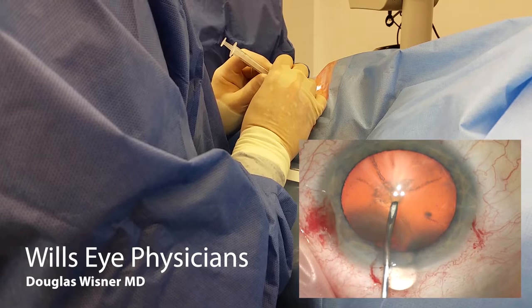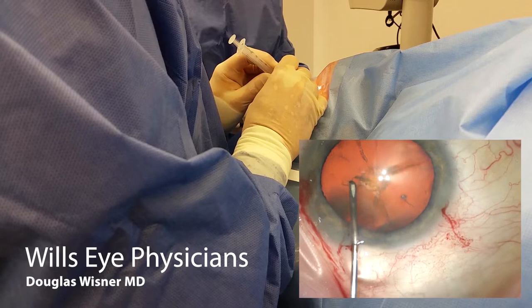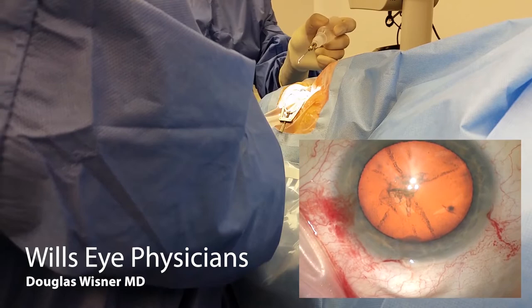Now I'm going to go ahead and open the capsule. I use the cystitome to initiate my capsulotomy. I'm left-handed, but I do a rhexis like a right-handed person would, so I move out and then pull down. Being very gentle at this point, lifting the needle tip off just enough to grab the capsule, not cortex, and flip over the edge of that capsule.